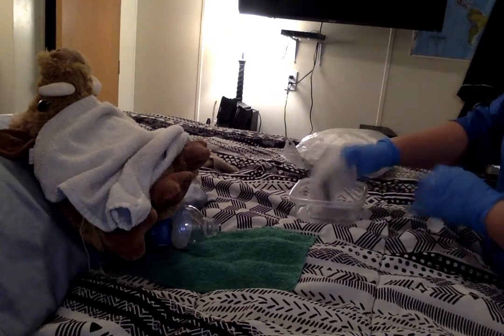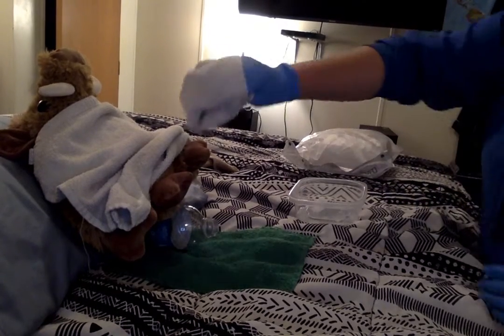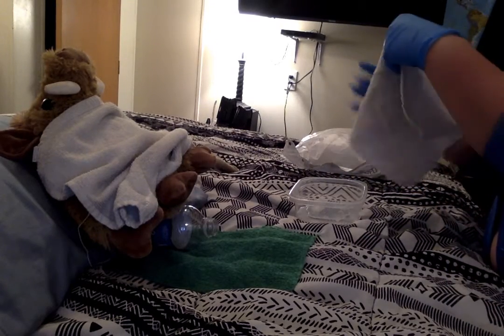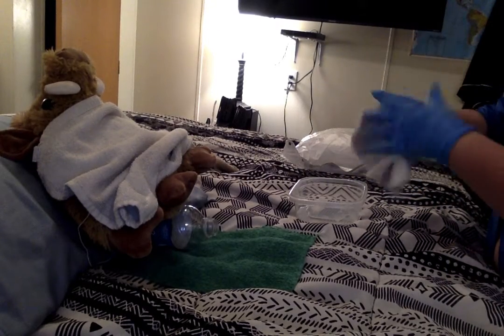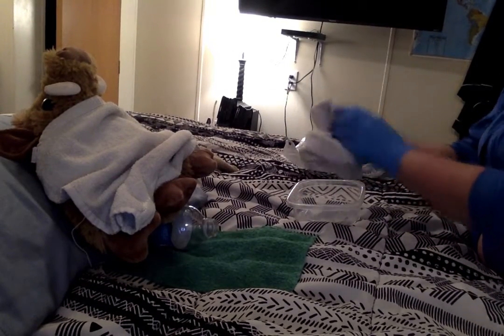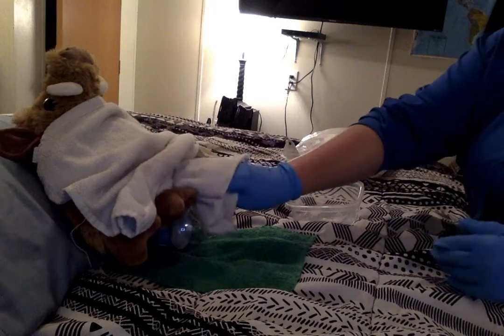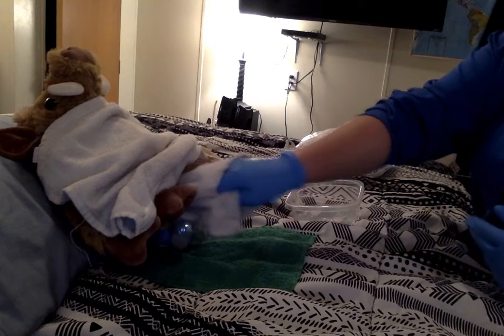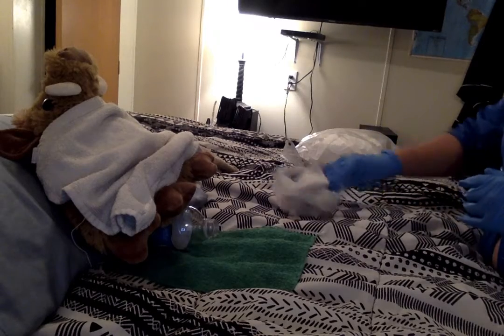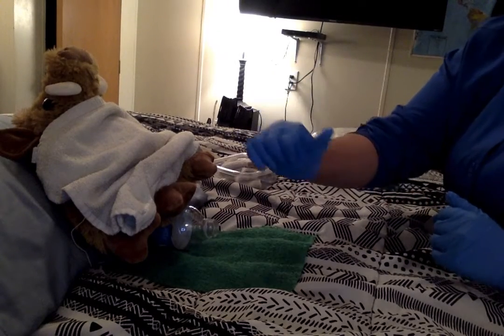We're going to dip this in the water and make sure it's not soaking wet. We're going to clean the side closest to us, then use a different side of the towel to clean the side farthest away from us. We're going to use a different side of the towel again, and clean down the middle. While we're doing this, we're also identifying the meatus. This is difficult to do sometimes, so we can get a light and look.